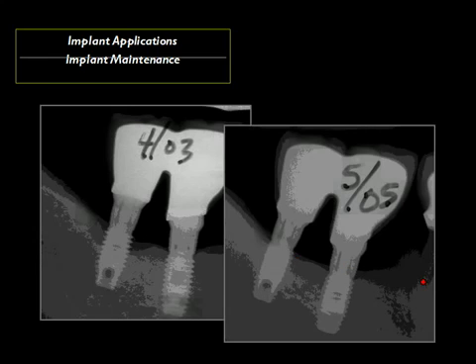We increased the amount of contact on the bicuspid here by allowing that to contact first, delaying contact here, but truly having contact there. So these are functional, but functional at an appropriate time that not only allows for a healthy crest, but in this case, regenerated lost crestal bone.